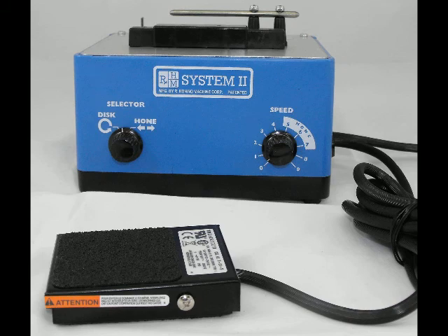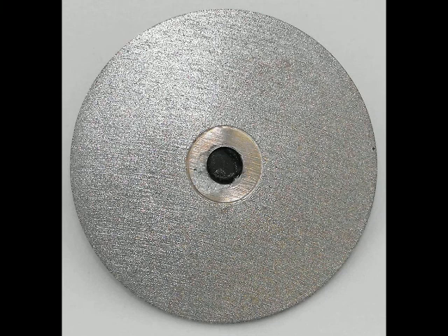This is the RX Honing System II machine. You can see the disc selector and the speed selector on the front of the machine. We will be getting into these in greater detail later on in the video. Next, we will be going over the tools necessary for basic hygiene sharpening.